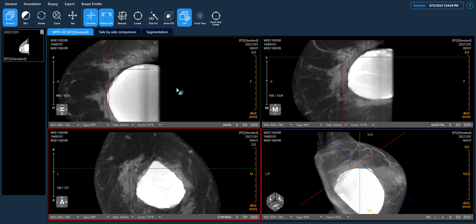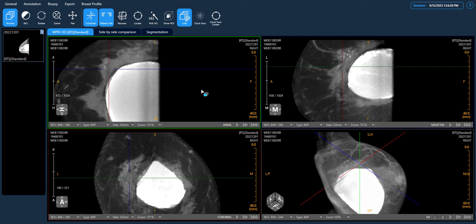Pathology results have confirmed that this calcification group represents ductal carcinoma in situ.